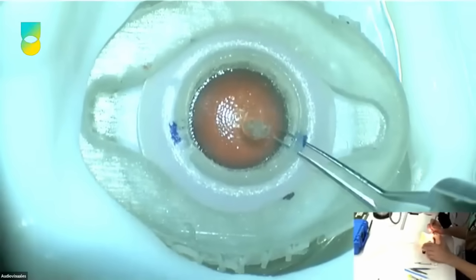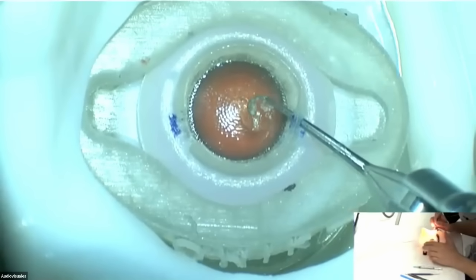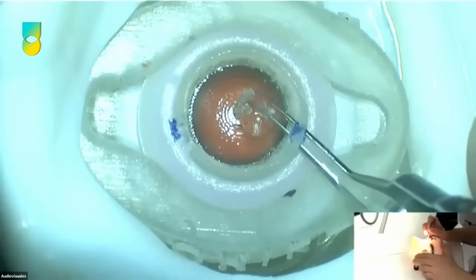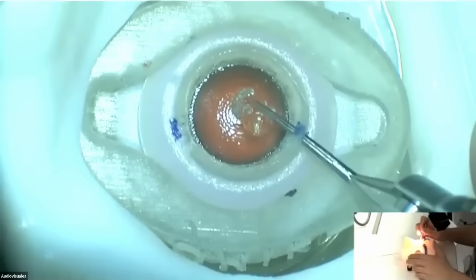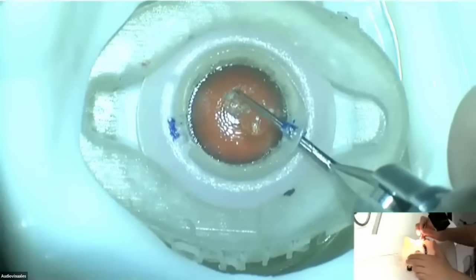The big thing with making the capsulorhexis, I agree, is being aware of where your instrument is in the incision, because you actually want to be pivoting within the incision and not at the edge of the incision, trying to gape the incision open up or down. So you actually want to use the incision itself and pivot the instrument within it to get to where you need to go. And that's important for a few reasons.